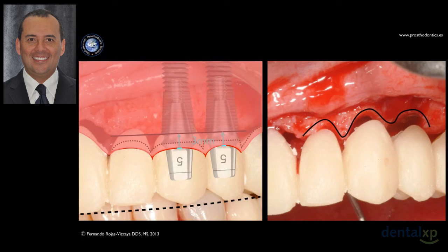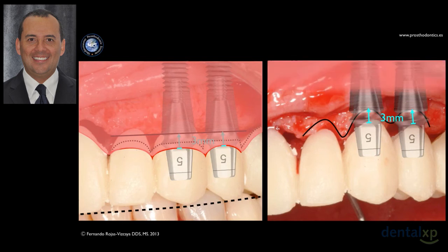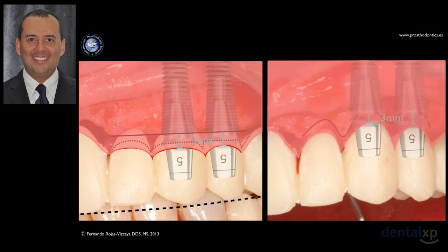But on the other side, where we follow the direction of the prosthesis and place the implant from the margin 3 millimeters apically, I make the reduction like in the molar that I showed you at the beginning. So now you have the implant deep enough to create the space for pink and white aesthetics. You connect your abutment, and this is after you suture and after healing. You can see the difference.